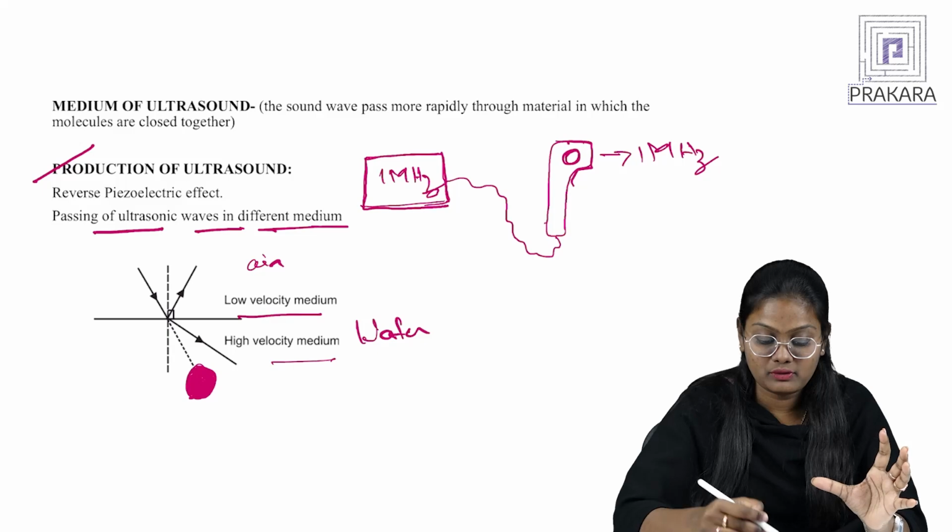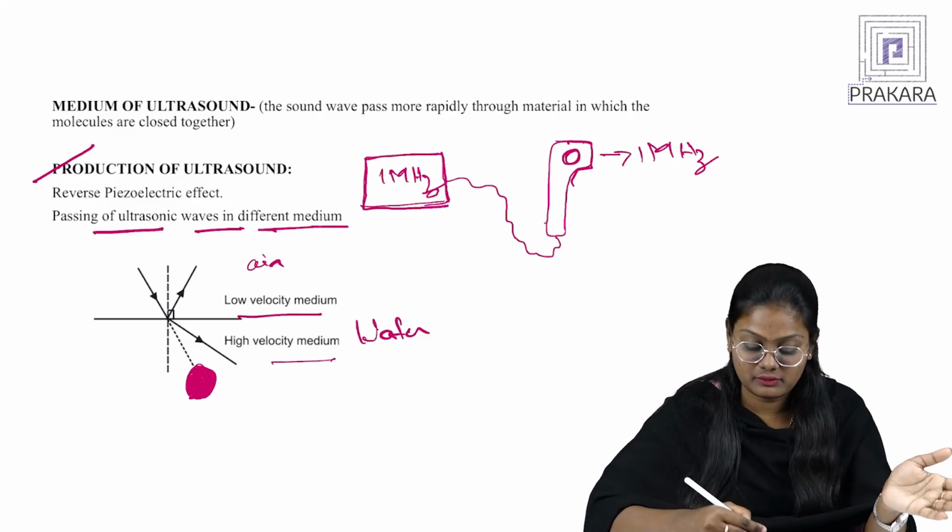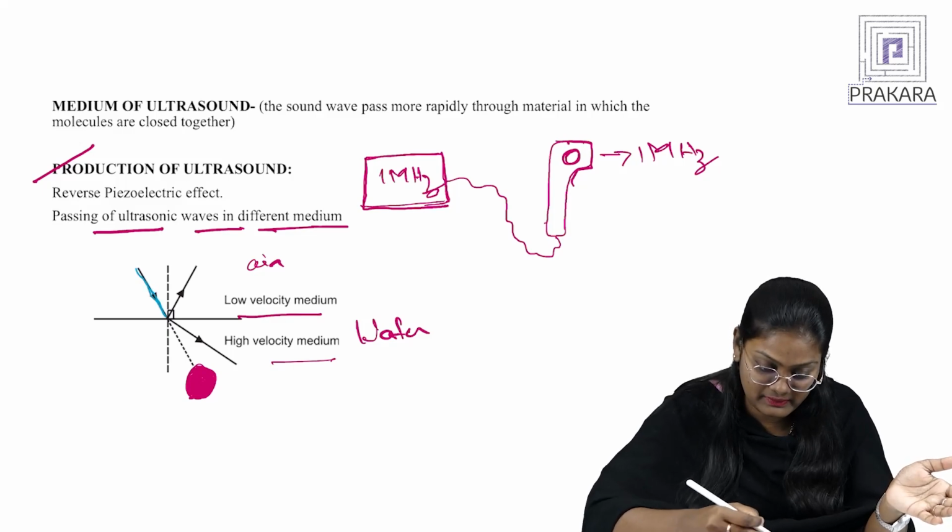Now what is happening over here is, I am placing the ultrasound in an angular manner. I am placing it like this, in a cross manner.